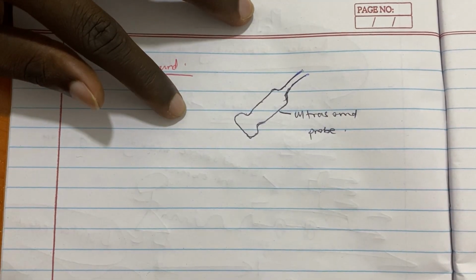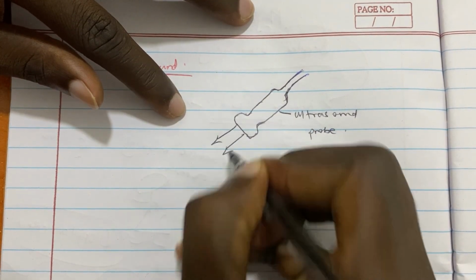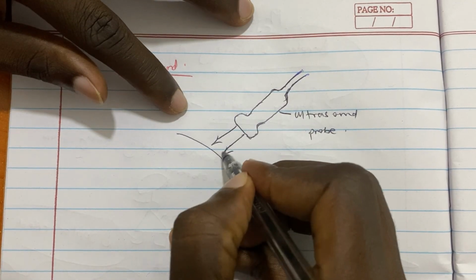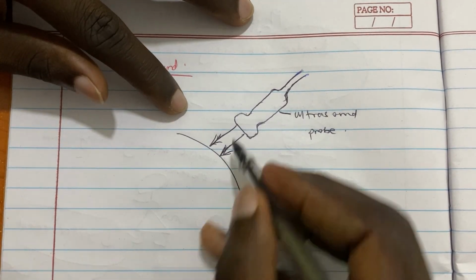It produces ultrasound through the piezoelectric element, which is excited by electric current. It keeps on bending, and whenever it bends, ultrasound is produced. Now this ultrasound is projected into the tissues. This can be an abdominal scan.